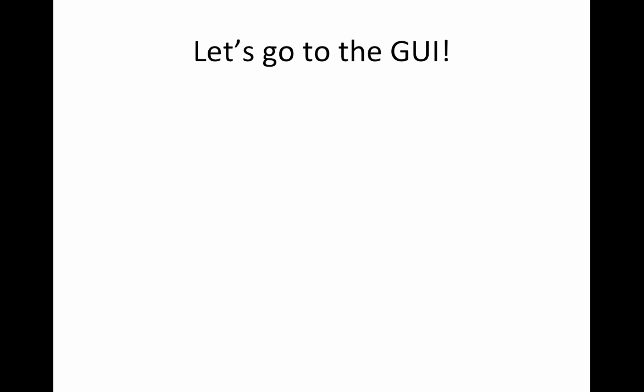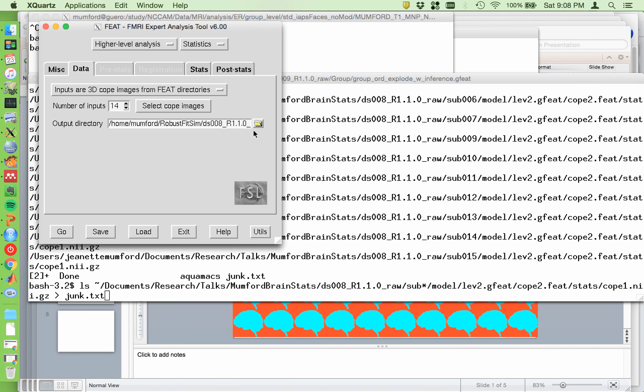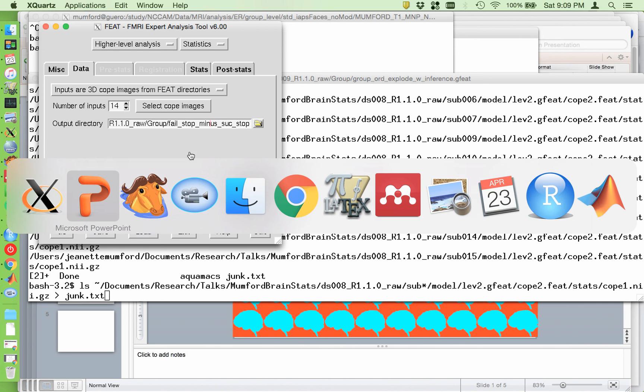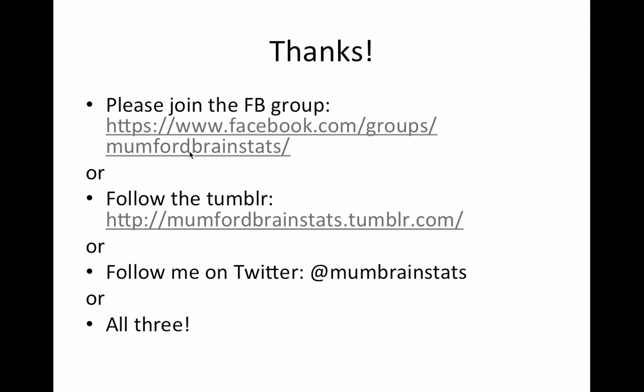Oh, I guess I didn't show you this, but I set the output name right here. So cope2 was fail stop minus successful stop. So that's what I'm going to name my group gfeet directory. Oops, and I don't want a bunch of x's in there. All right, that's it. It's a real short one. I'll do the QA. That's the last step. And that'll be it for the FSL series.